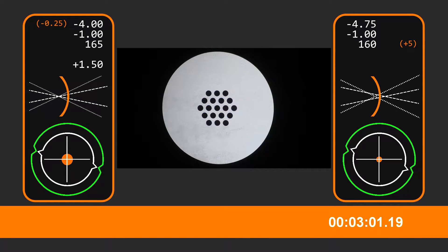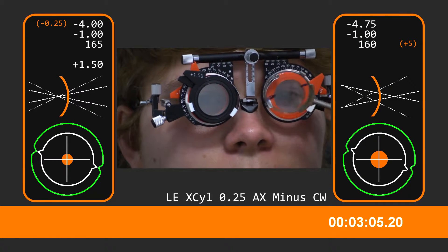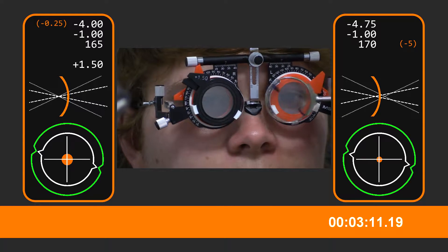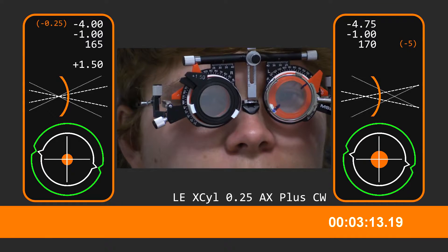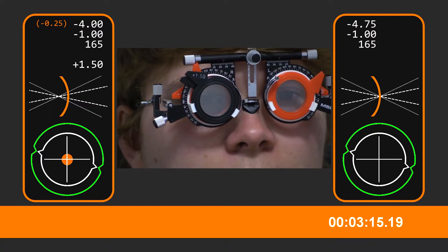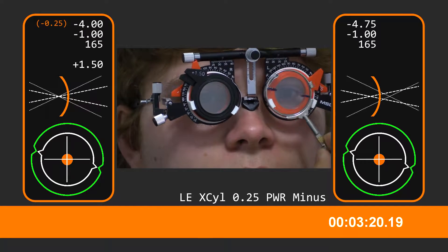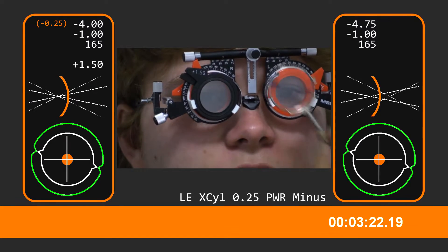And we'll have a look at those spots there. Which of these is clearer, first one or second one? First. Second. First one. Second. First. And these two — first one or second? First. Second. First. Not much in it, is it? No, not much.